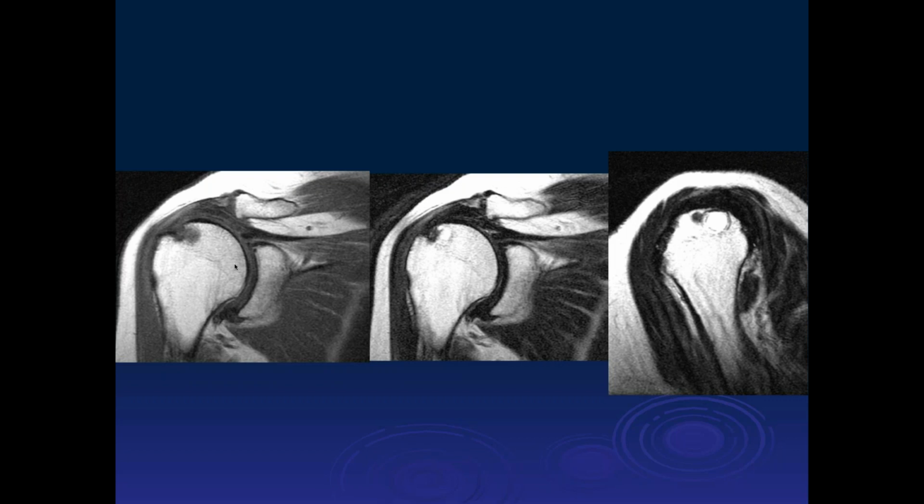So where's the musculotendinous junction of the supraspinatus? It looks like it's at the level of the glenoid, or maybe even more back here, right? Yeah. Where's the distal end of the tendon itself? About here, like at the glenoid AC joint, somewhere around there. Probably right there. So what's all this stuff here? Scarring. Yeah, so this is our scar in situ.